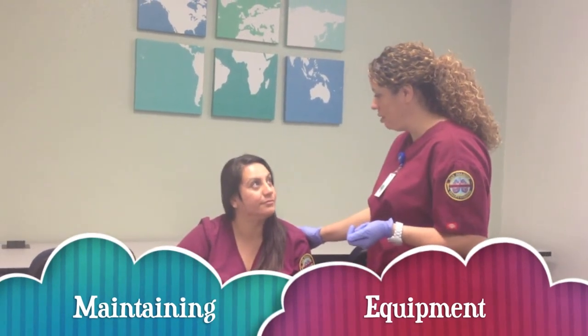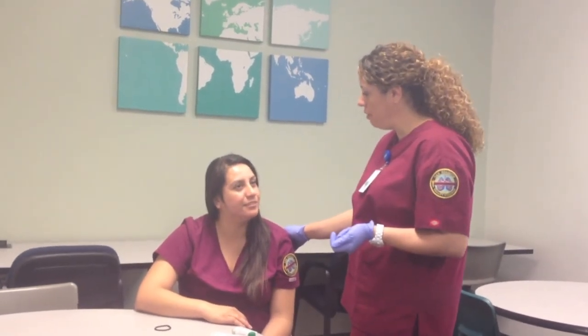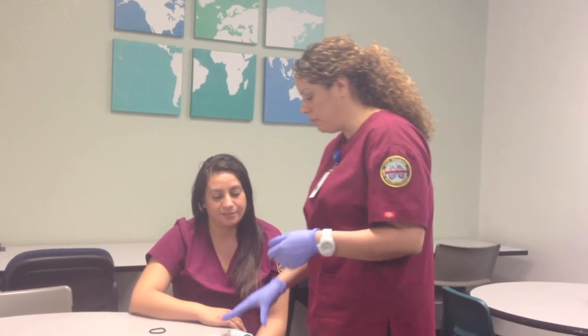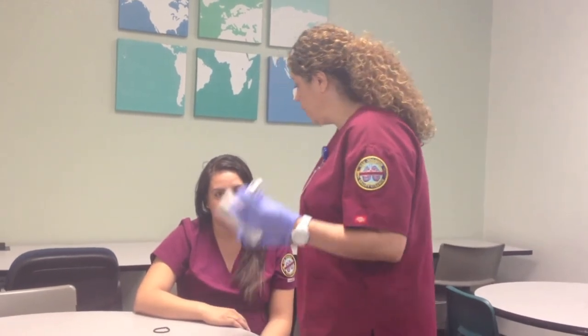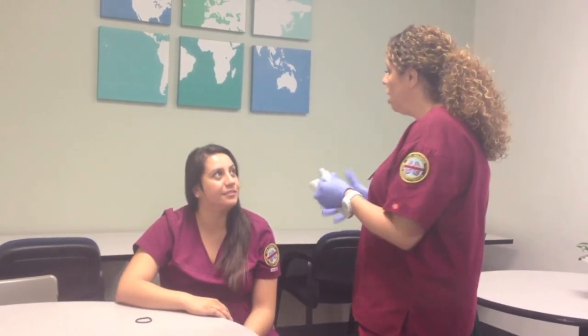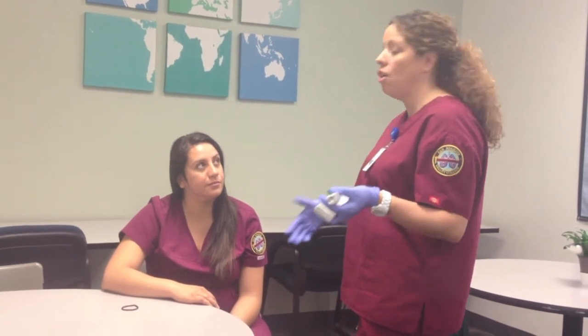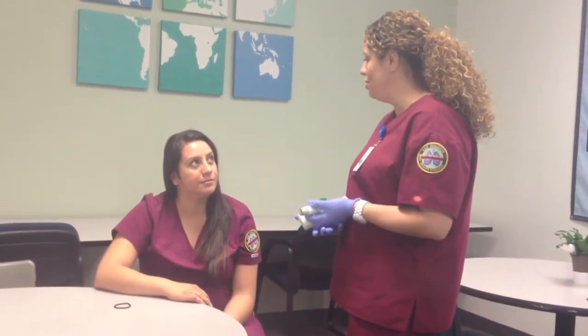Now we are all finished with your treatment. Do you have any questions for me before I leave? How often did you say to take it? Well, the doctor ordered it every four hours as needed. So I'm going to clean both of these off with an alcohol swab or sterile water and then put them back at the nurse's station. In four hours, if you feel that you need it again, the nurse or I can come back and administer it.